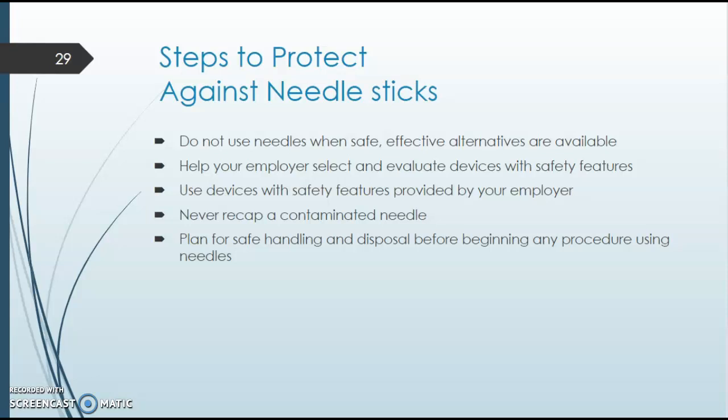Never recap a contaminated needle. Very, very big one here. You definitely don't want to do that. Once a needle has been used in a patient, it is therefore contaminated and can transfer disease. So if you want to recap a needle, just put it in the safety sharps container and get another needle, because you don't want to recap.